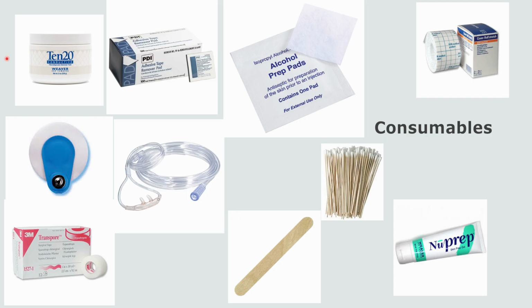Consumables are the supplies needed for a sleep study that are one-time use only. 1020 paste is conductive paste that electrodes are filled with. This is to stick to the body as well as to create an electrical connection between the electrode and the skin. The thing that makes 1020 paste conductive is salt.